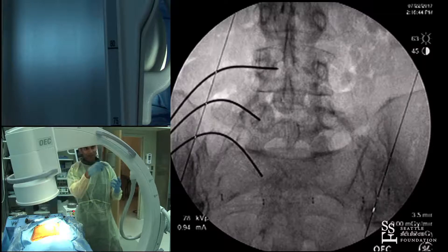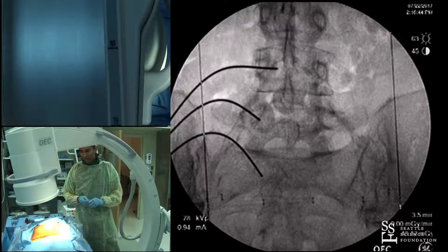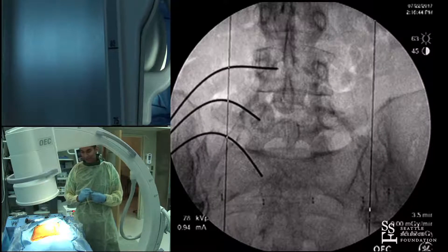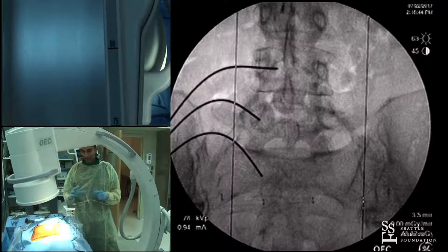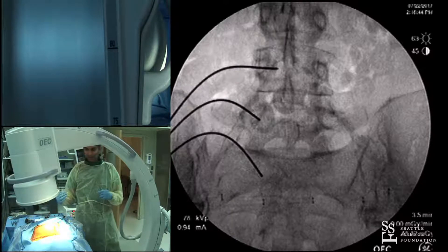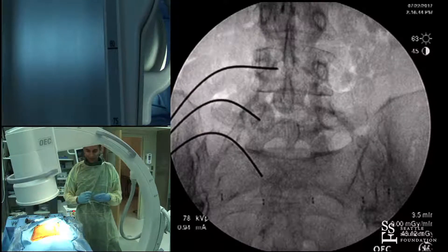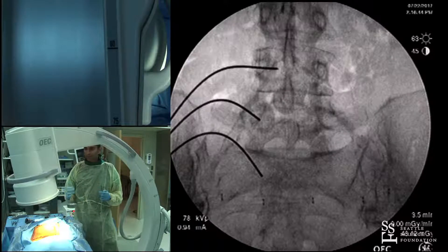Second, you should be collimating — tighten the image, verticalize it. Also, you want to be comfortable when you do a procedure. I typically do degen scolies and low-grade deformity cases. I always stand on the patient's right side as a right-handed surgeon, with the fluoro on the opposite side of me, which helps minimize radiation exposure.